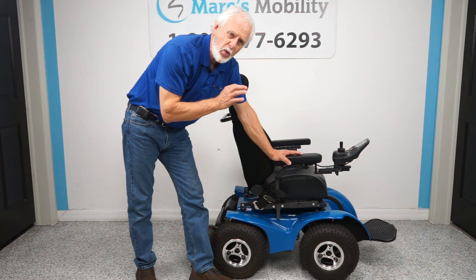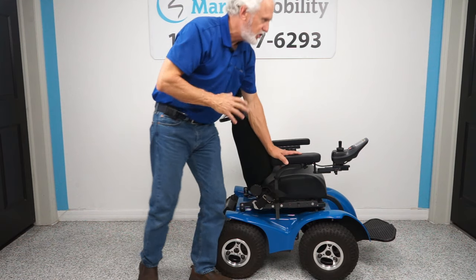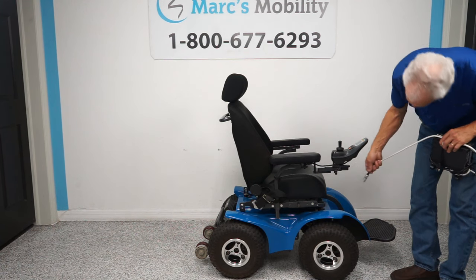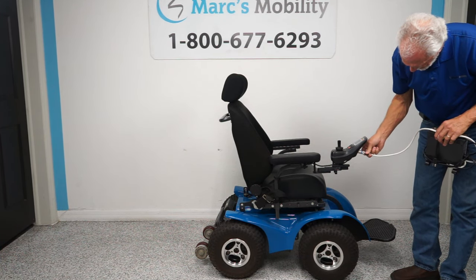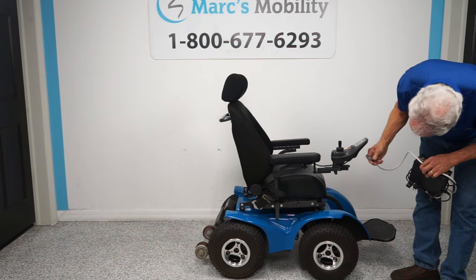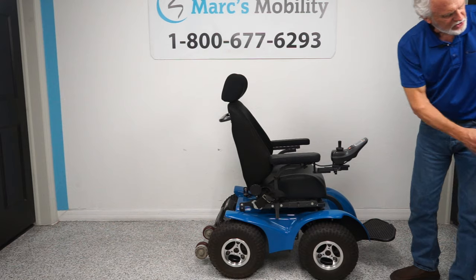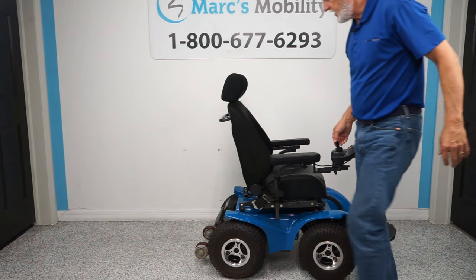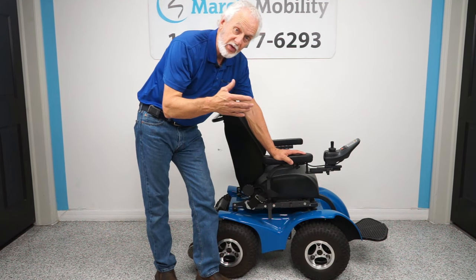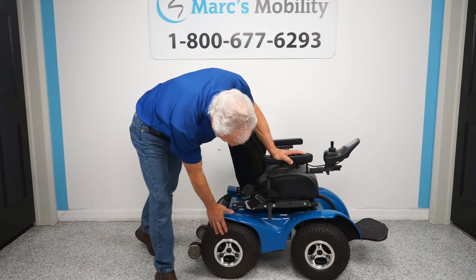This chair will go up to 6.2 miles an hour — that's the top speed. When you charge the batteries, you plug the charger in right below the joystick. As soon as the light goes solid, your batteries are full and the charger stops charging. You have five speed settings: one through five. When I show the video outside I'll have it on five.